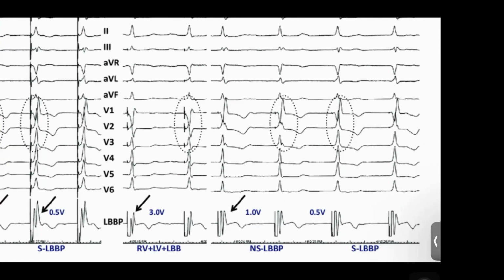When decreasing amplitude to 0.5, we have selective pacing with initial R, not different from non-selective pacing. But here, if we use a bipolar configuration, we have a wider area of activation, of stimulation. But when you use unipolar, we go more for selective.